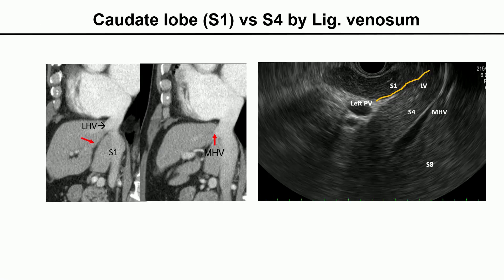Ligamentum venosum is a very important landmark. This ligament separates the caudate lobe S1 from S4. When the EUS probe is rotated more clockwise, going back to the EG junction or the gastroesophageal area, the ligamentum venosum is seen as a thick hyperechoic band on the EUS image. Ligamentum venosum extends up to the termination of the left hepatic vein and middle hepatic vein. The inferior vena cava covers S1, and S4 is divided by the ligamentum venosum. The middle hepatic vein divides S4 from S8.